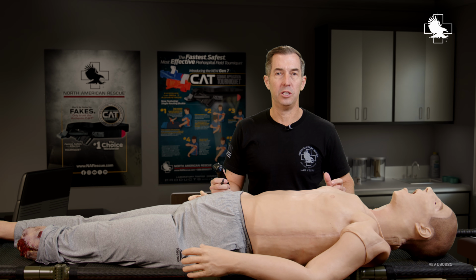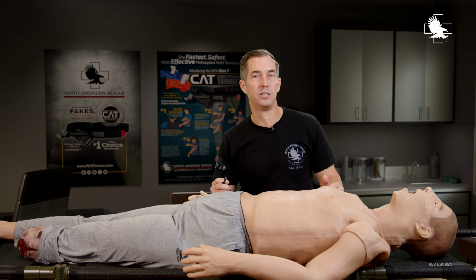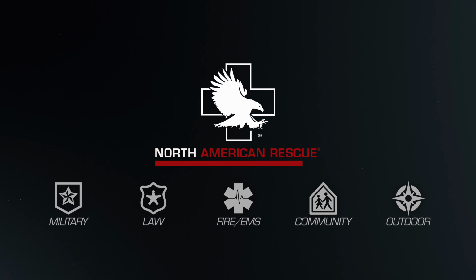I'm going over some of the uses of pre-hospital ultrasound to help guide care in patients. One area where ultrasound can be particularly useful is determining whether or not your patient has a pneumothorax. Sometimes it can be confusing.